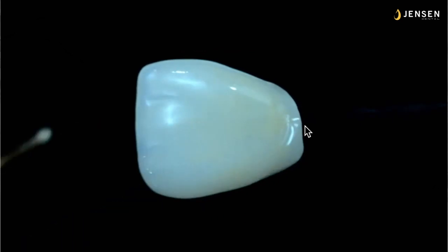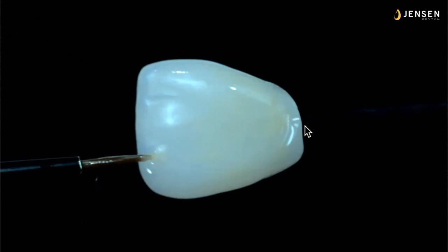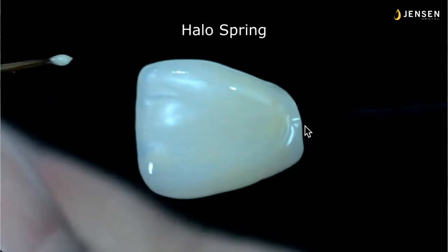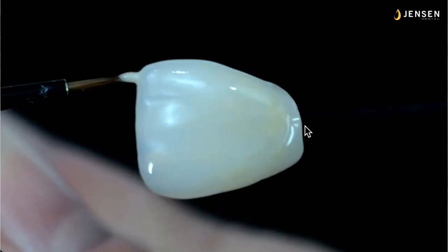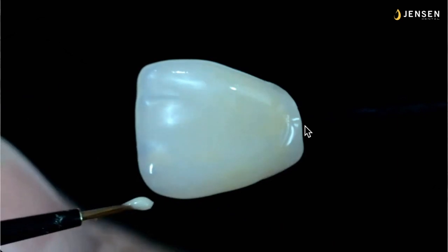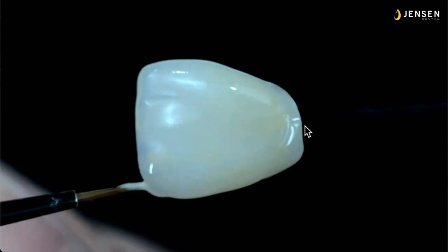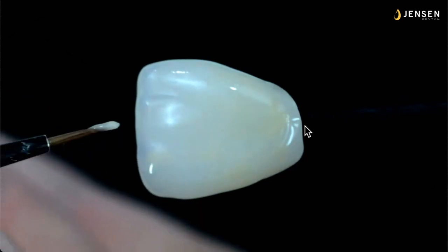So here's a little bit of coral. And I don't want to get it way too thin, but I have it thinned down a little bit more than the storm, and it glides right off the brush and gives me a mamelon color. And here I'm coming back with the halo spring. Now you're drizzling it just like icing on the facial incisal edge. And remember, there's paste glaze on that edge, so all I have to do is just lightly touch it, just kiss it with the tip of the brush, and that color slides right off.